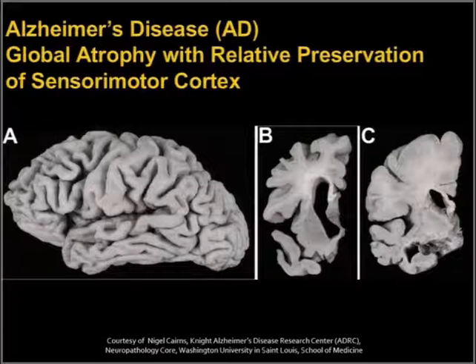correlates to. We've had this for a long time, but I can tell you as a neuroradiologist, what the information we give you from a scan like this is pretty limited. We tell you there's advanced neurodegeneration, and you already knew that from your clinical exam.